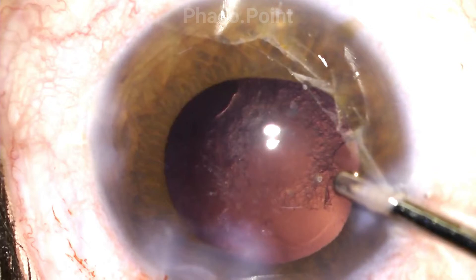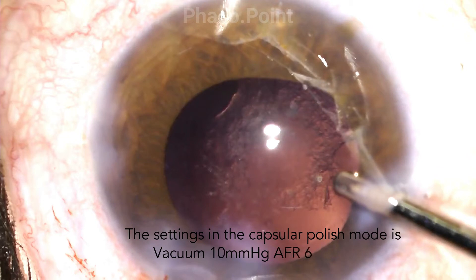Now here are the important considerations when performing a posterior capsular polish. Please understand that it is an extension of the irrigation aspiration. However, since we are working so close to the posterior capsule — aiming to release the cells stuck to the posterior capsule and aspirate them — we clearly need to work with lower settings. The settings we work with are a flow of about 6 ml per minute and a vacuum of no more than 8–10 mmHg.